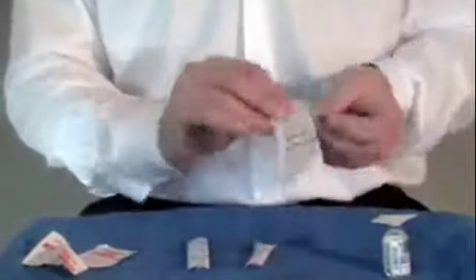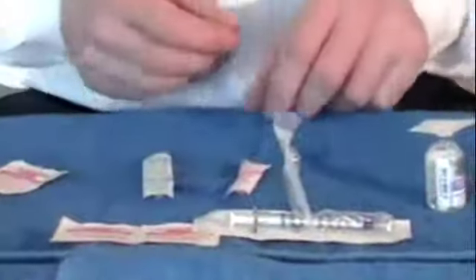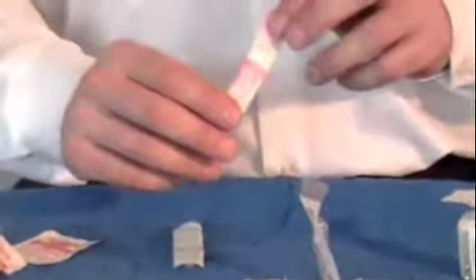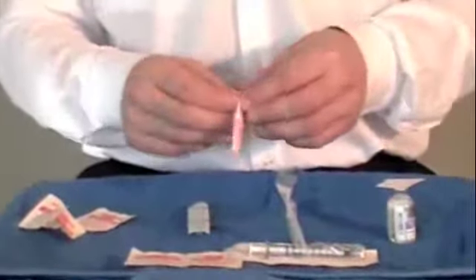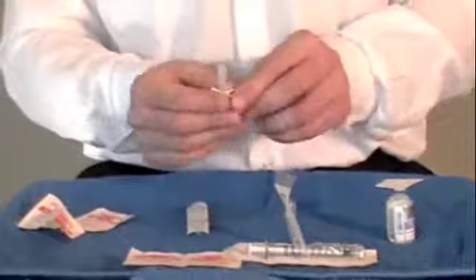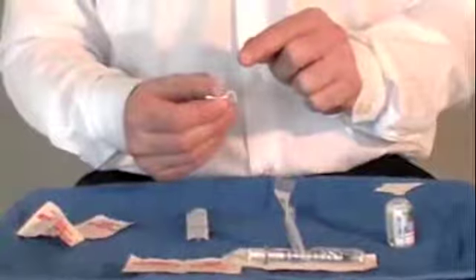At this point, you'll want to grab your 1 cc lock syringe, peel back the sterile packaging. You can then set this down, keeping the tip in the packaging to ensure that it remains sterile. You'll then want to take your 18 gauge needle. Again, you're going to peel back the packaging from the top. Hold on to the packaging to keep it sterile. Be very careful that you do not contaminate the hub of the needle.